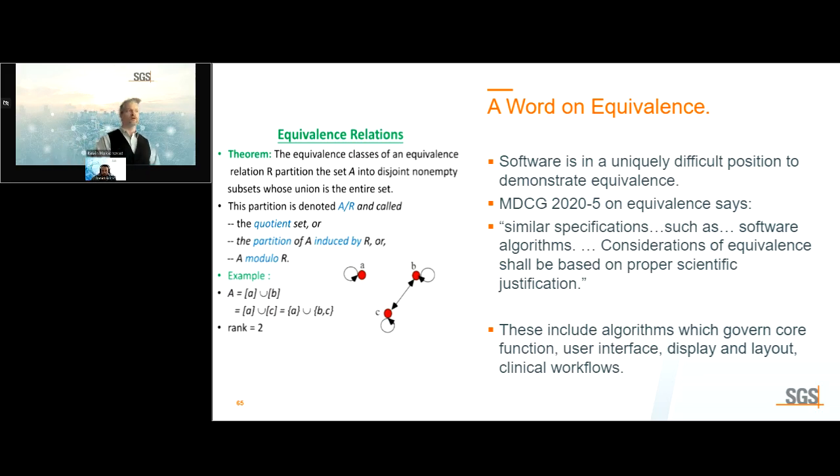Where it says similar, similar means similar. Where it says same, same means same. Truly identical, and we are not allowed a great deal of wiggle. Now, you will notice that it says similar, such as software algorithms. That can be very hard to prove if you don't have access to the data because it's a different legal manufacturer. If core algorithms have changed, equivalency starts getting very hard to prove.